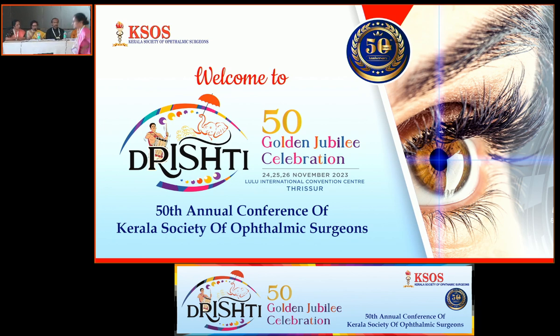Next speaker is Dr. Mini PA. She will be talking on calibration of applanation tonometer. It is very important to calibrate the tonometer before using it. Over to Mini.